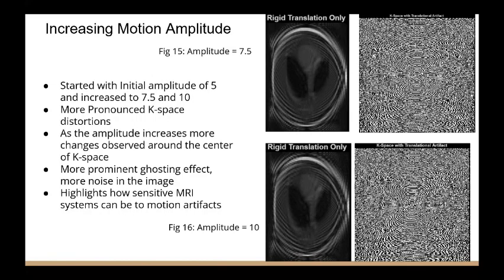This just goes to show how sensitive MRI systems can be to motion artifact. With even a small change in the translation amplitude, we got such a big difference.